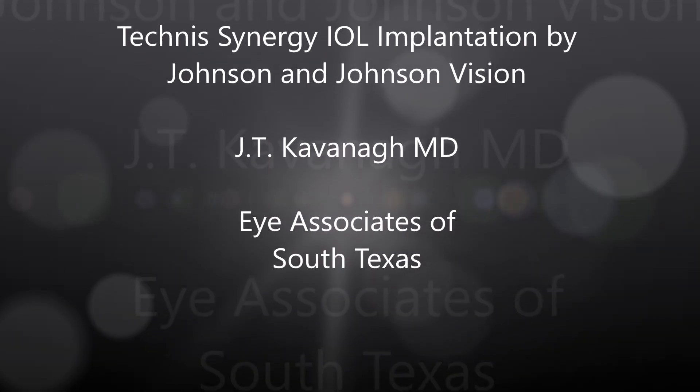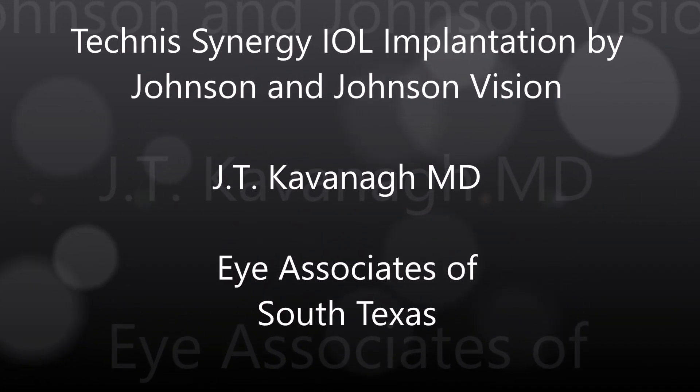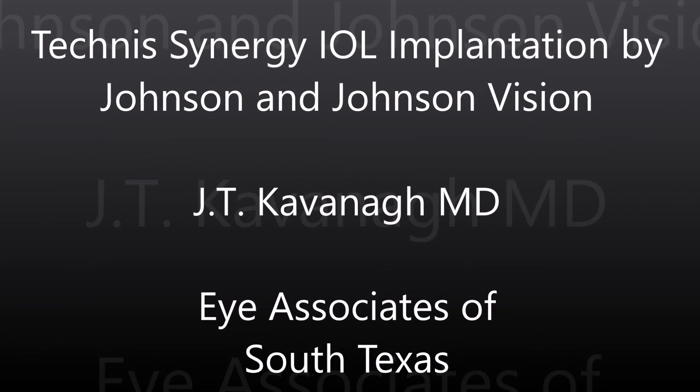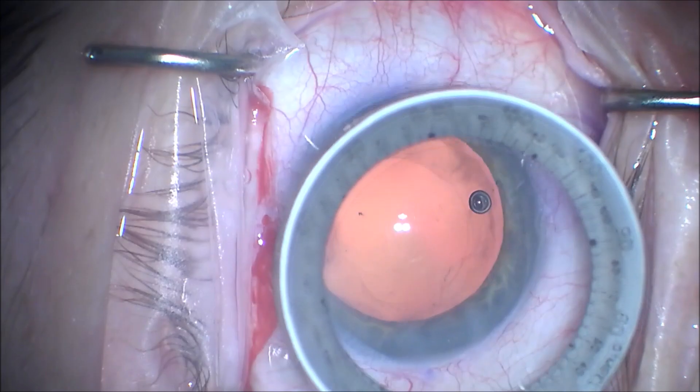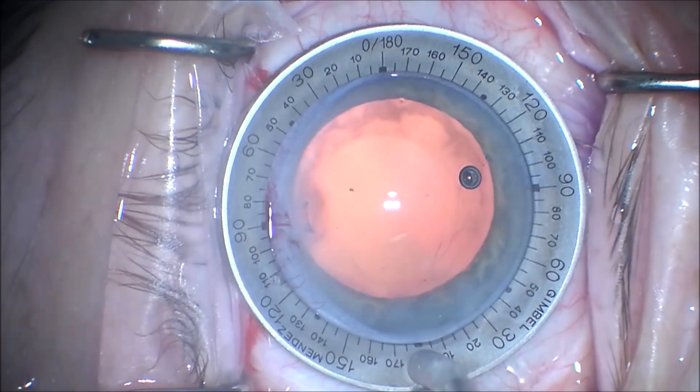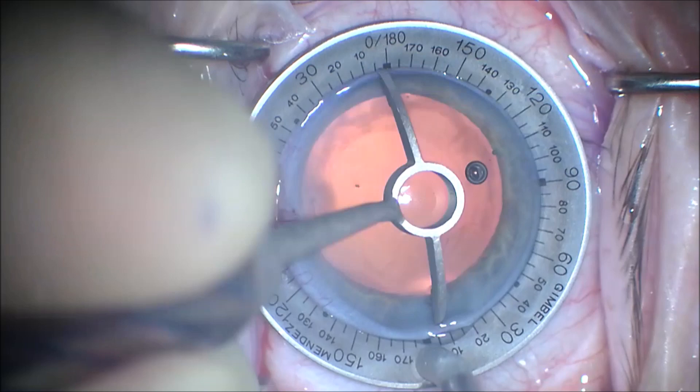I'm Kevin of Eye Associates of South Texas. I'm going to show you an implantation of a recently approved intraocular lens. This is the Technus Synergy intraocular lens, which is a combination depth of focus and diffractive intraocular lens implant.